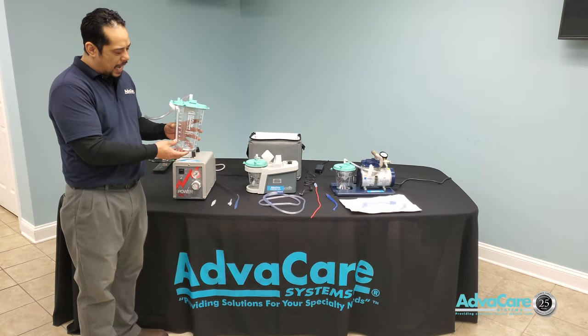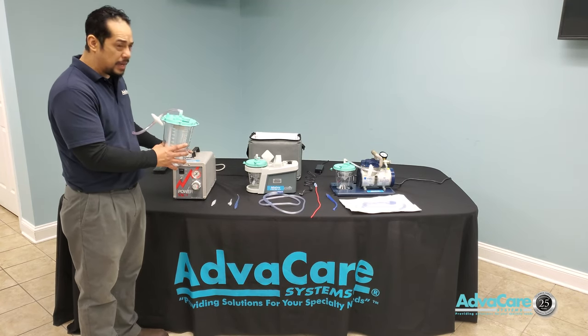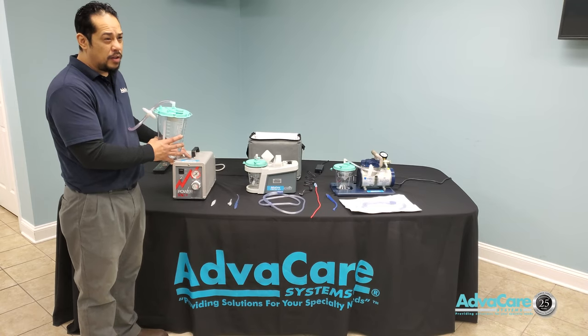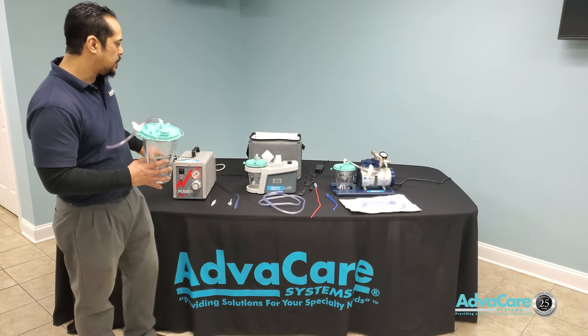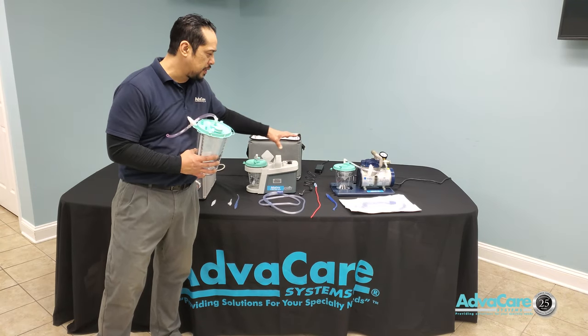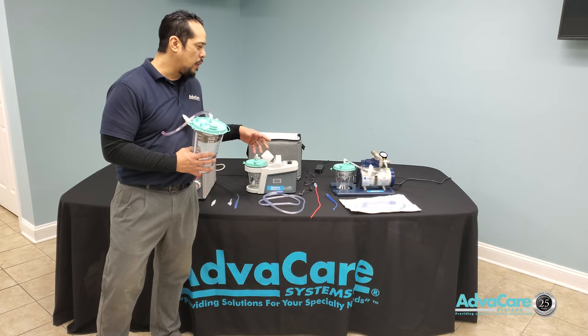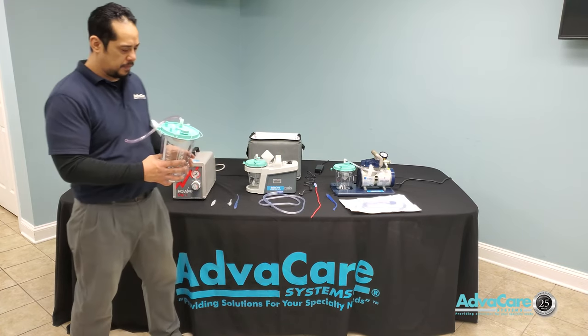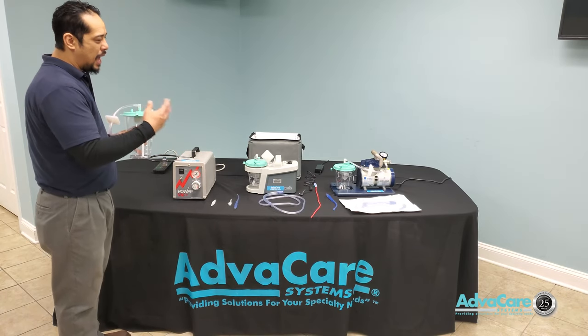The patient can be connected to the intermittent suction machine for longer periods of time unsupervised, whereas suction therapy from a continuous suction machine is always supervised and only lasts maybe five to ten seconds at most until the blockage is clear.